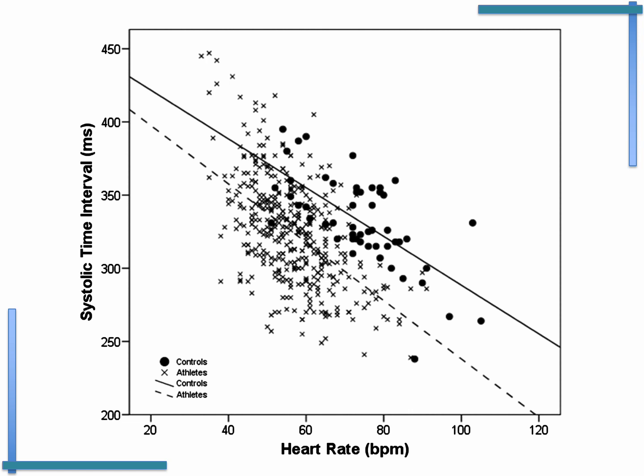Well, if the balloon pump gets triggered by the ECG and the machine knows the electromechanical coupling interval and it knows what the systolic time interval is for the patient, then it can adjust its deflation time reliably across a range of heart rates.